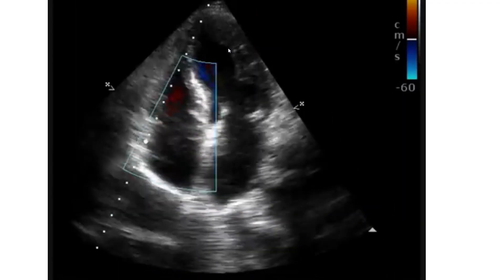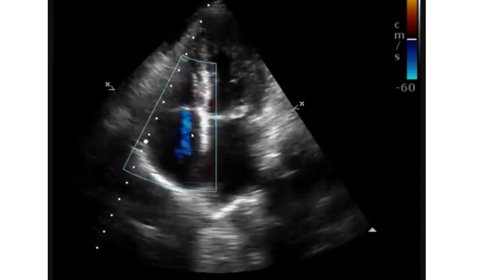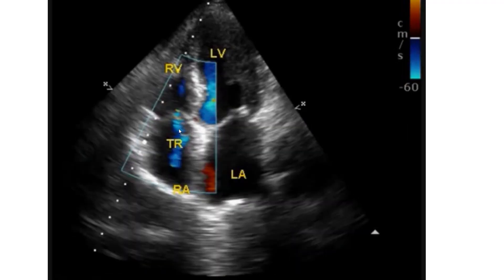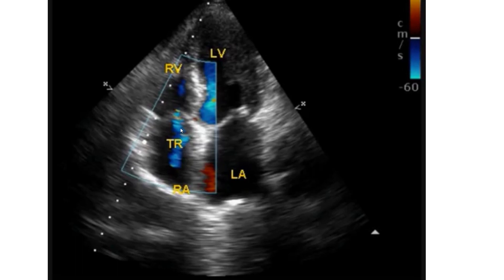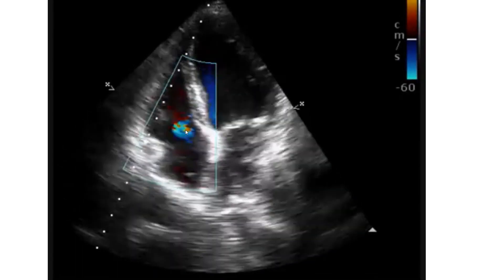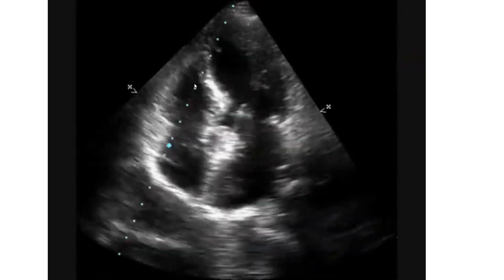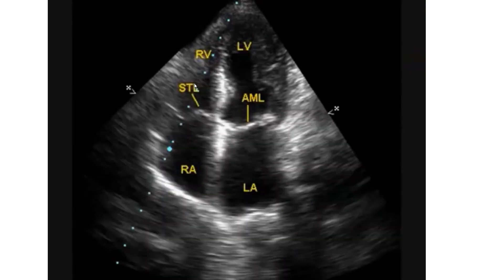The left ventricle is seen here. You can see a jet of color — blue color — that is the tricuspid regurgitation jet. You can see that the jet is flowing from the right ventricle to the right atrium.